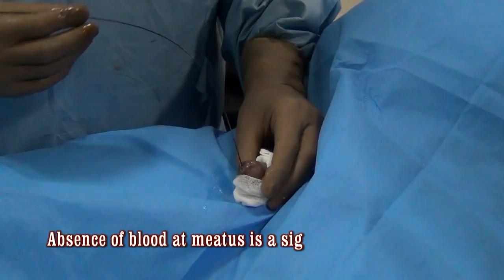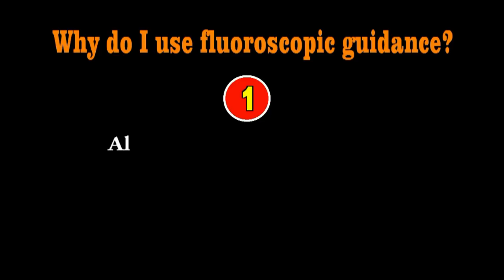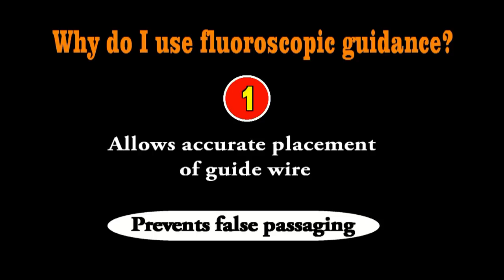Why do I recommend the use of fluoroscopic guidance during dilatation? First, it allows accurate placement of the guide wire. If the guide wire is accurately placed through the stricture, through the prostatic urethra and into the bladder, then your dilatation is safe — you will never create a false passage. That is one clear advantage.